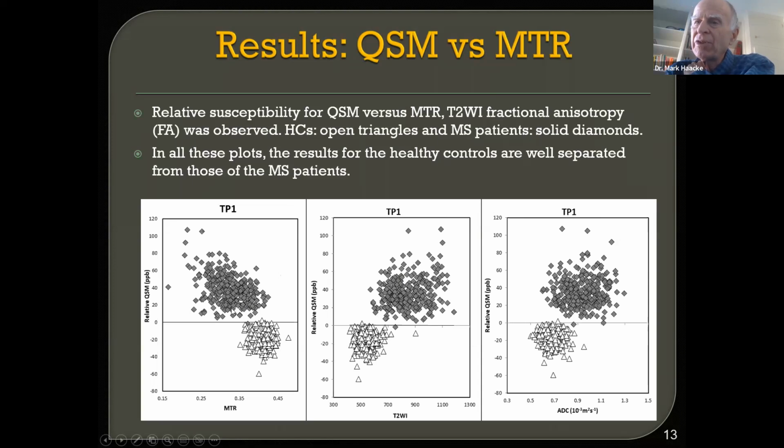Some of them only have very small susceptibility, so not so highly demyelinated. And it's now believed that we may be able to differentiate inflammatory-only lesions, which would be the ones that have maybe very low susceptibility, from those that are demyelinating lesions that have the very high susceptibility.